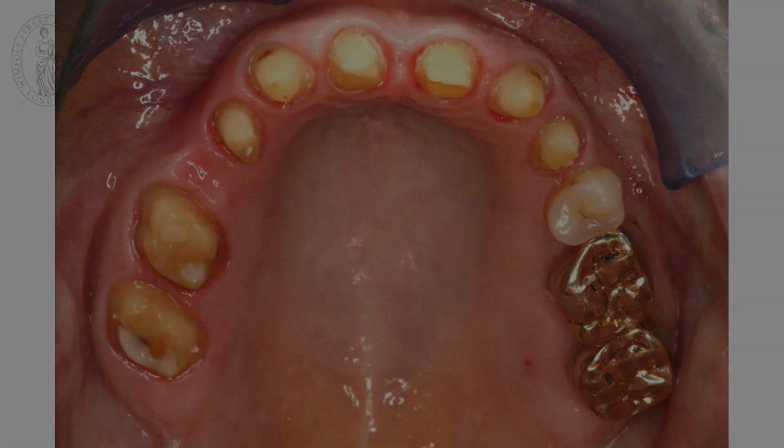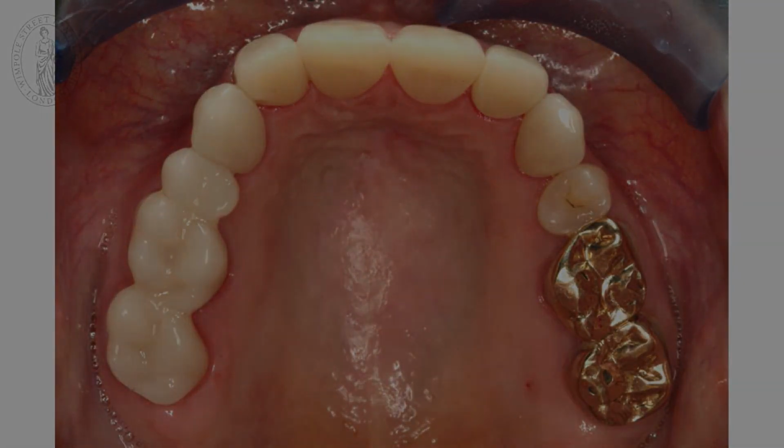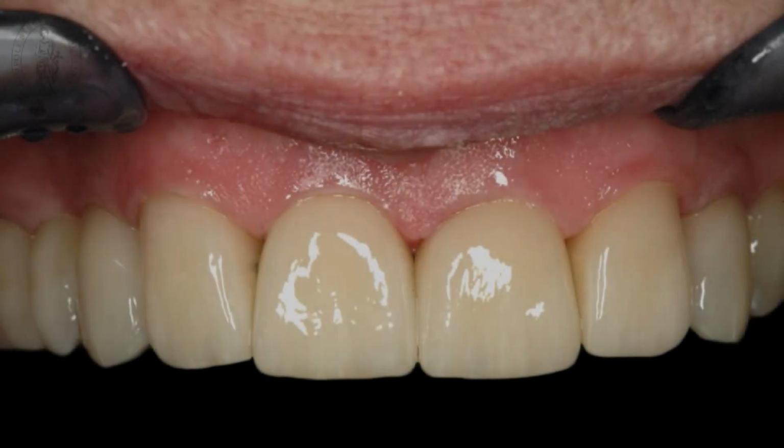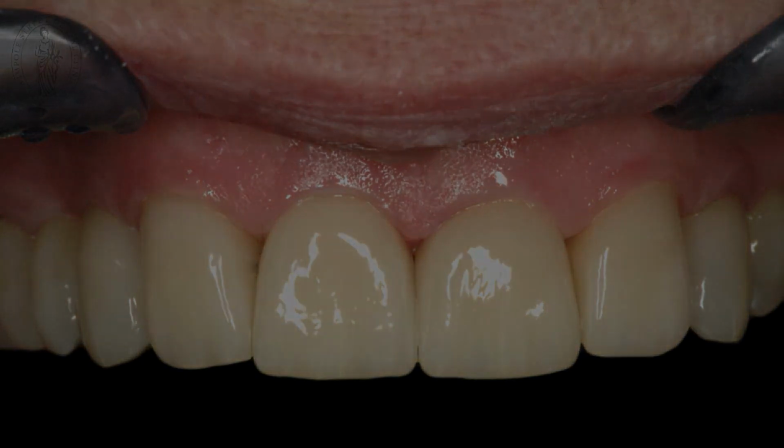And that's the situation then with the try-in and then the final situation cemented after 1 week. And you can see these teeth look quite natural. The gums in between the teeth will still have to recover a little bit because of the placement procedure. We have to push the gums a little bit away so that the crowns really cement properly onto the tooth.